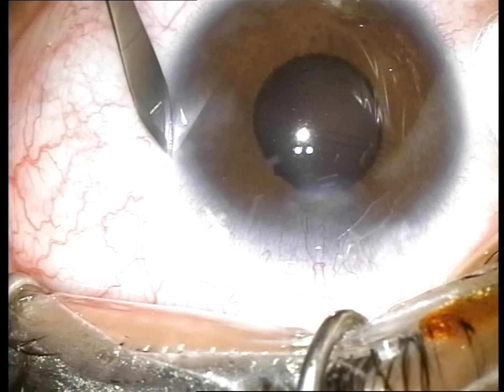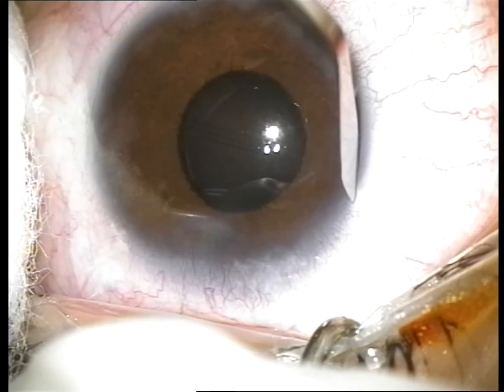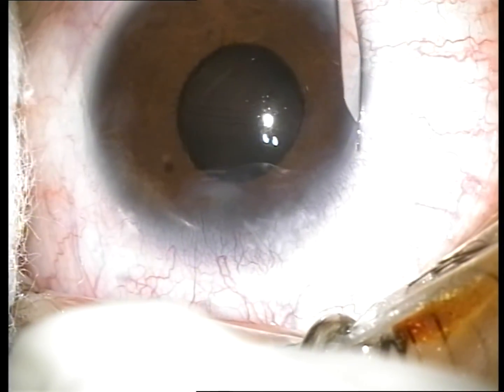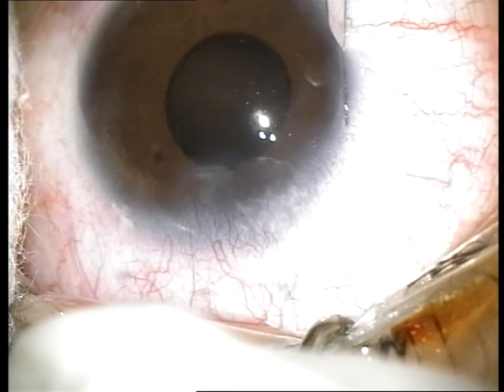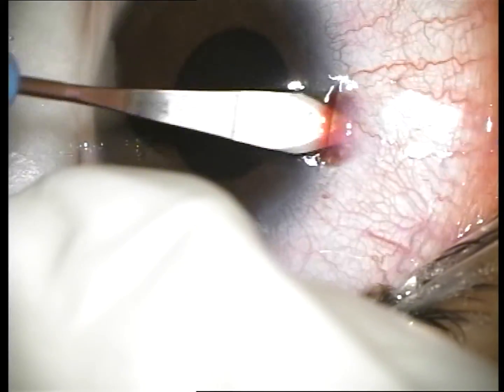Two scleral pockets about 3 mm wide are dissected posterior to the two 180-degree opposing clear corneal incisions using a metal 2.2 mm clear-cut blade.